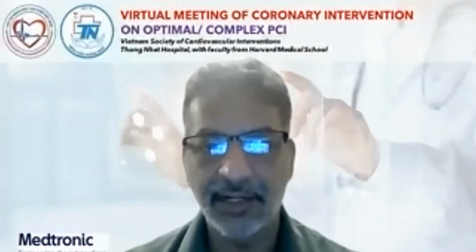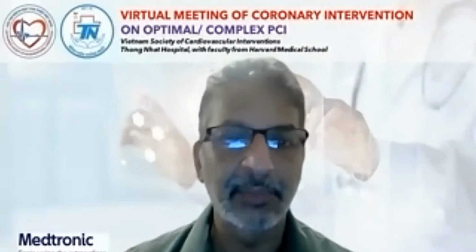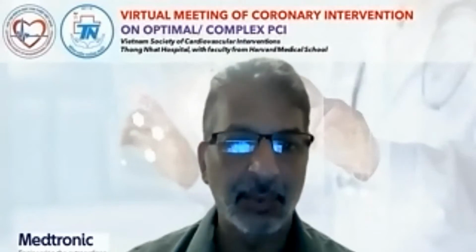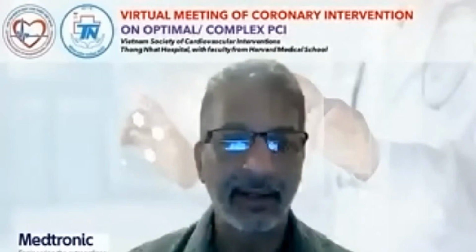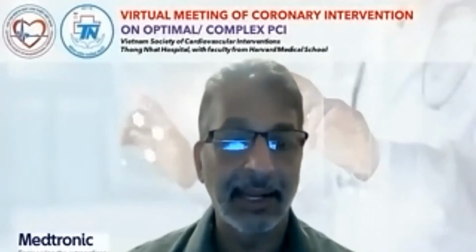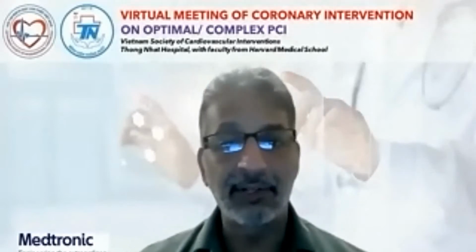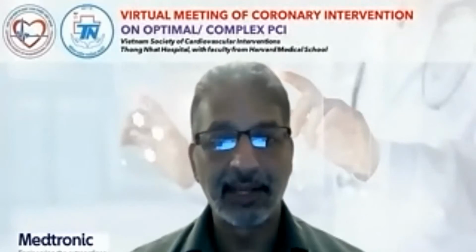I don't know what the ejection fraction was in this case or whether the patient was compensated before, but you can see the extreme stress on the patient and the operators that happened when the patient's left main dissected. That would have been a very stable situation with an Impella in, and you would have had more time to think and to deal with the problem. Now, obviously, this case turned out great, but I don't know that every single operator would be able to accomplish what was accomplished here.